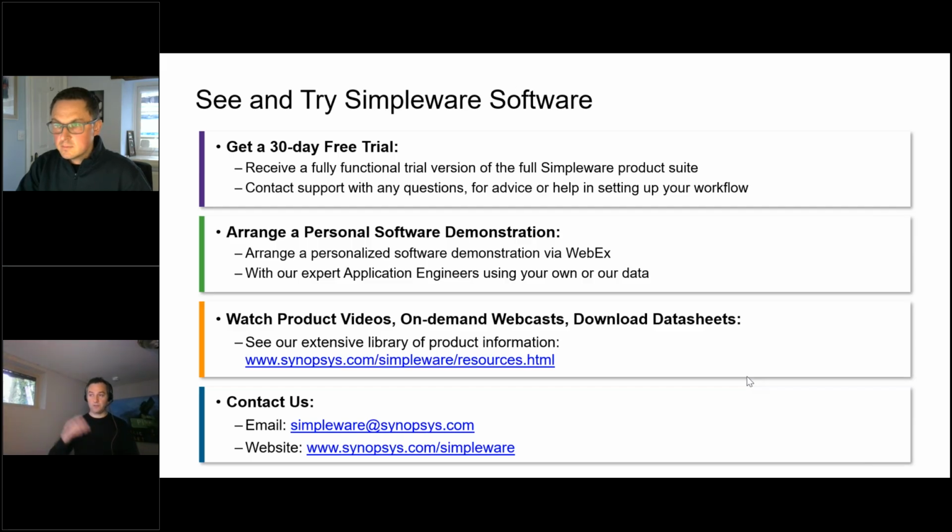And then from there, we'll define a statement of work where we define all the parameters for success, what you're expecting in terms of results, and make sure everybody is on board, and we'll sign it, and that's basically your PO. So the cost of that varies significantly. I'd hate to even provide a window now. It just depends on what type of segmentation you're doing, what type of data, how much data, whether you're doing the segmentation, whether we're doing the segmentation, if we need a formal clinical review, things like that.